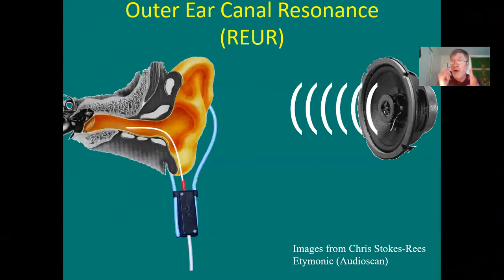Who cares? Well, we do care, because the sound's coming out of the speaker, and what we're doing is measuring the resonance of the outer ear canal. It's a quarter wave resonator, open at one end, closed at the other, much like my coffee cup.